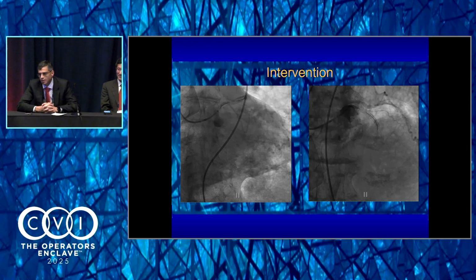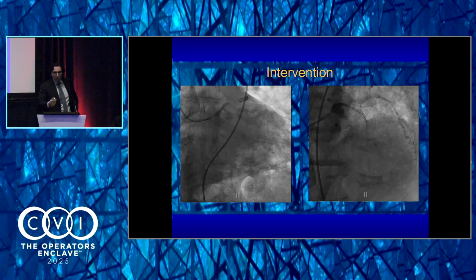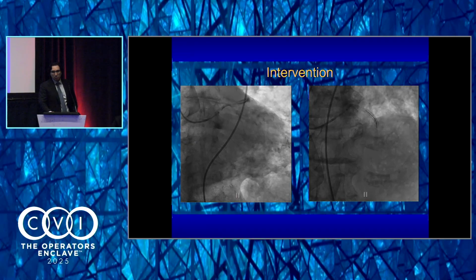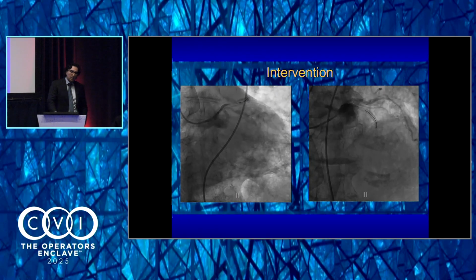Sure, and you're absolutely right. I did have to exchange out for a 25 centimeter sheath, a little bit longer to get past the iliacs. Got a wire down, and then I couldn't deliver anything else but a 2.0 balloon.